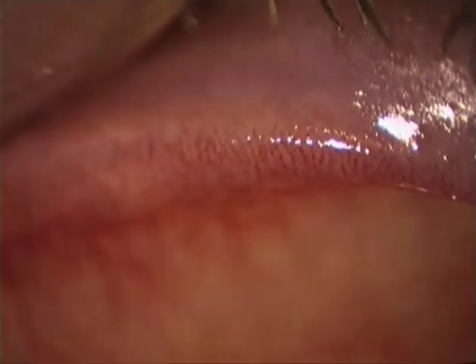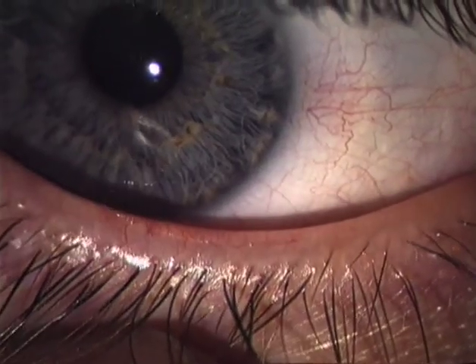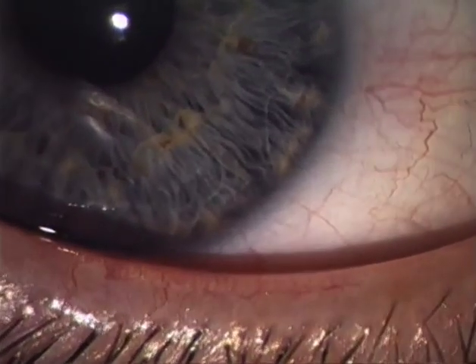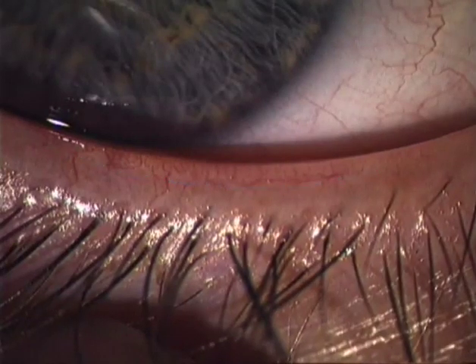Normally, the vascular border is the end of the network of the superficial conjunctival capillaries, which, in the lower lid, form an irregular network, and which, in the upper lid, are arranged in parallel lines. As a slight variation, the end of the capillary network at the vascular border may be marked by a delimitating capillary arcade.